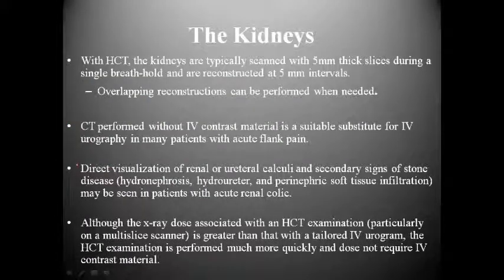So that brings us to the kidneys. This is one of the most common things that you're actually going to be scanning. People have abnormalities with the kidneys. You're going to see people come in complaining of lower back pain with a history of renal stones. You're going to see patients come in with maybe elevated blood pressure or low blood pressure, or orthostatic hypertension or hypotension. Things like this are all going to be possible reasons for you to scan the kidneys.